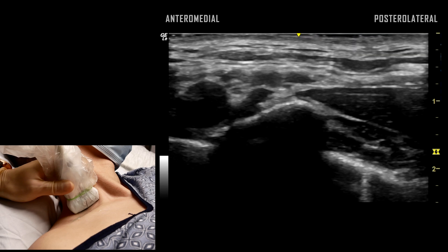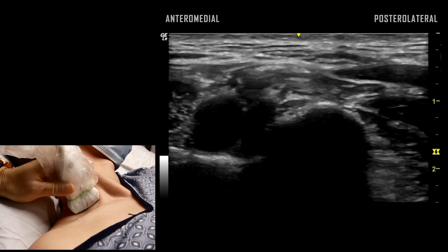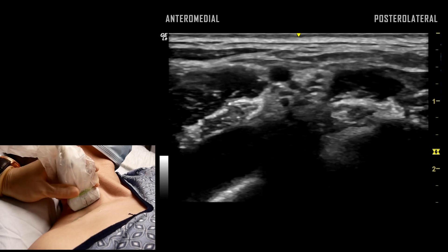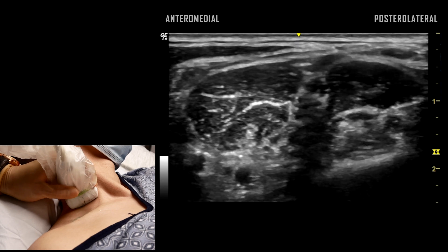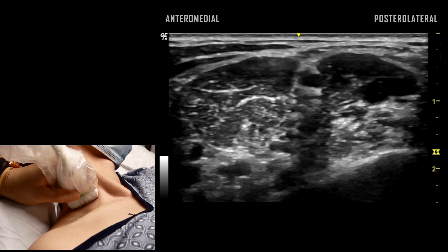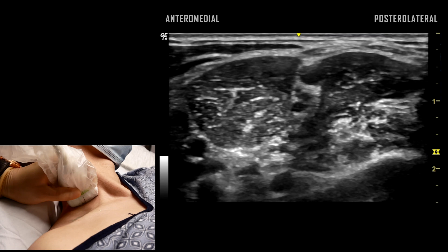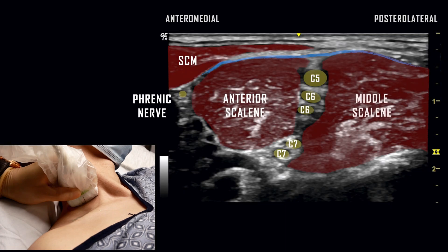As the probe is translated cephalad, components of the brachial plexus are visualized between the anterior and middle scalene muscles. This view is that of the interscalene approach, where individual nerve roots are identified including split C6 and C7 roots.